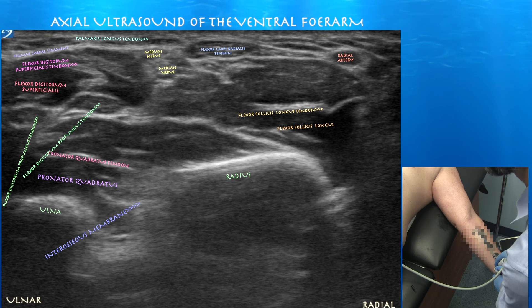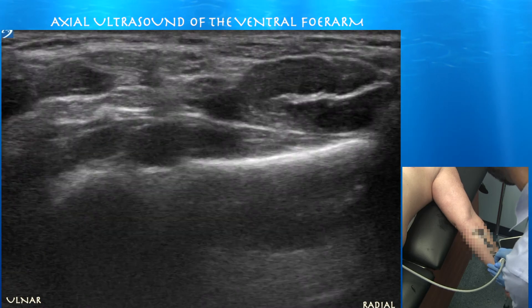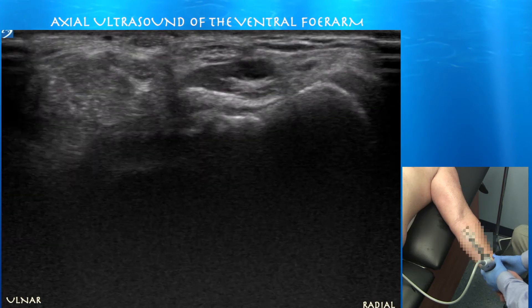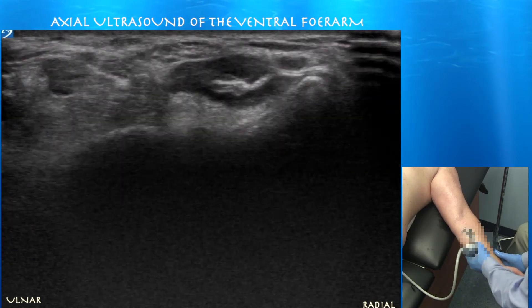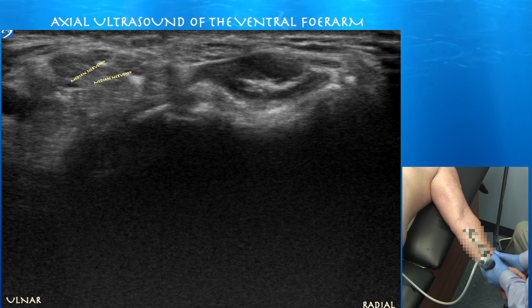Here it appears that there's actually a bifid median nerve, which occurs in about three percent of the population and usually it splits towards the distal end of the transverse carpal ligament. Here again you can appreciate a bifid median nerve.